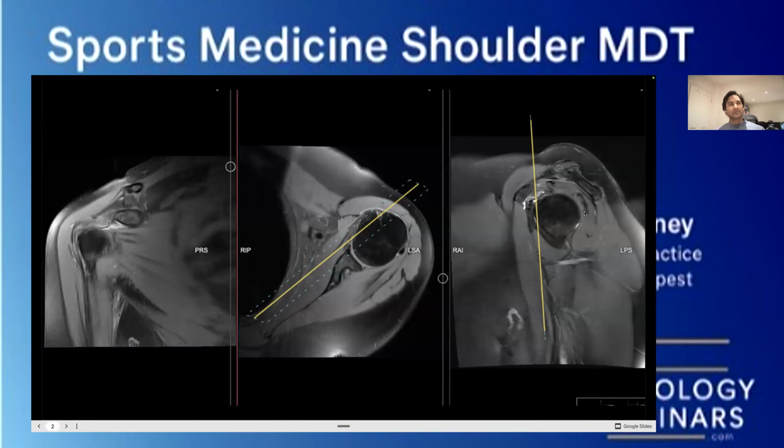There's a little bit of fluid around the glenohumeral joint, which also suggests they've got adhesive capsulitis. Maybe very, very mild, but it's probably there too. So we've seen quite a few things on this one scan, and we've also been able to relate it to key anatomy that's useful for anyone looking after patients. So, Irfan, I think there are a few questions that you may have had for this person. Did you have any questions you wanted to ask?